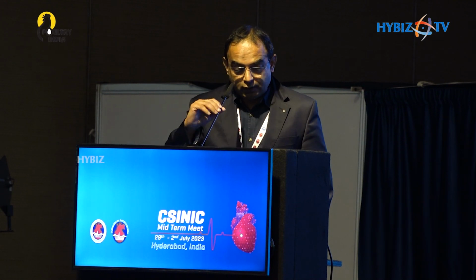we opened the strut with a 2 mm balloon, and then we did a kissing balloon with 3 in the circumflex and 3.5 in the LAD, and we did a POT again, and then we checked the OCT pullback from the LAD as well as the circumflex. So this was the OCT pullback, and this was the 3D navigation mode, as well as the 3D reconstruction.